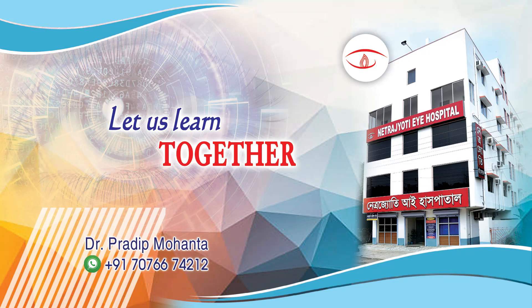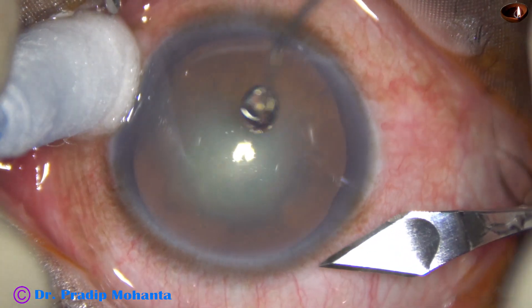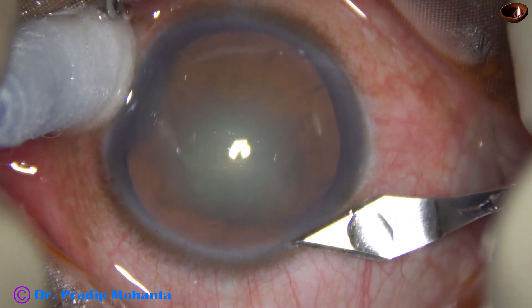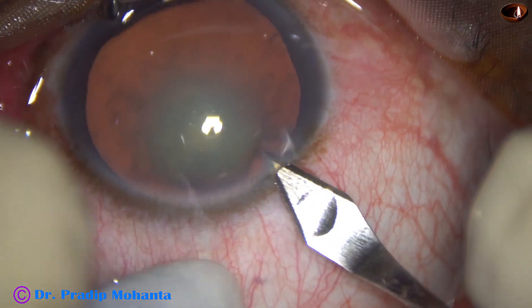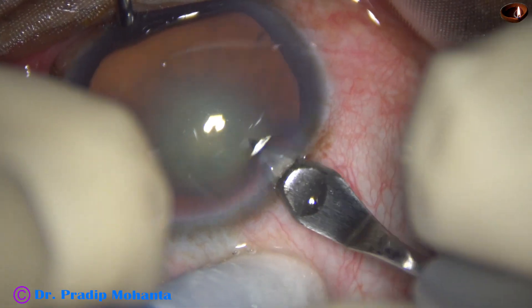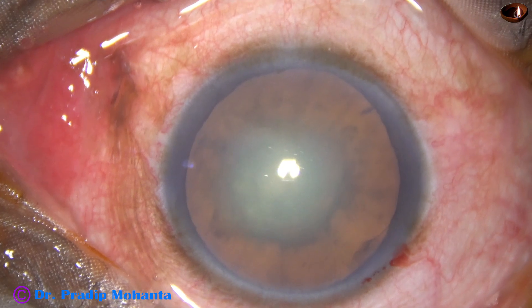Friends, welcome to my workplace at Ranaghat, West Bengal, India. This cataract appears like a posterior polar cataract, and I am going to take some precautions which are usually taken in a case of posterior polar cataract.